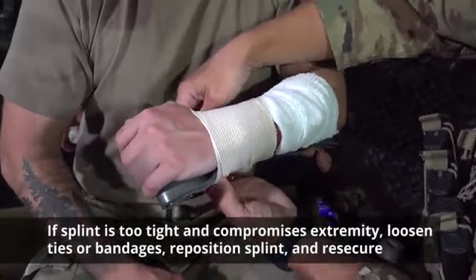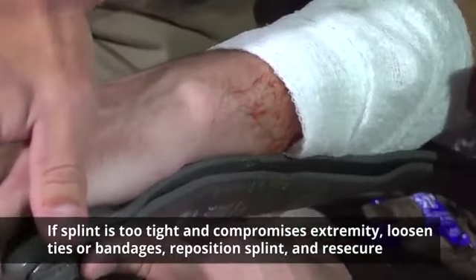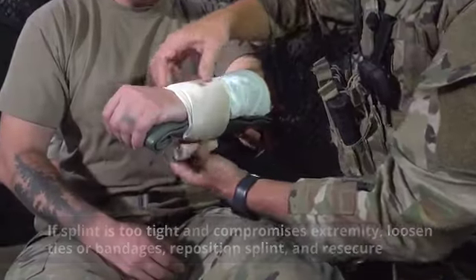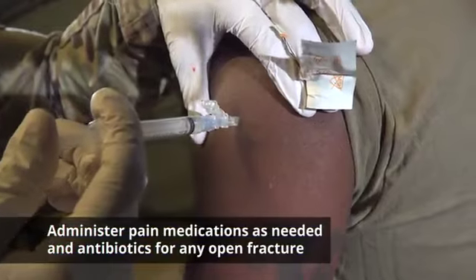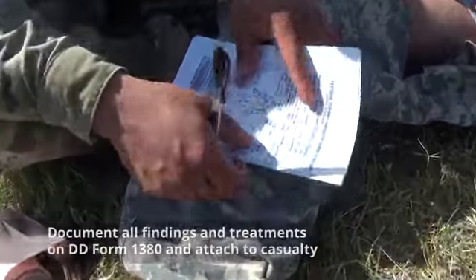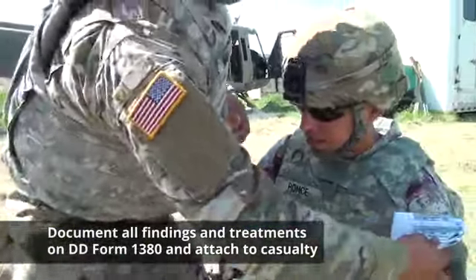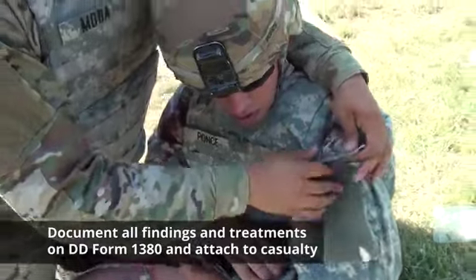If the splint is too tight and compromises the extremity, loosen the ties or bandages, reposition the splint, and then re-secure it. Administer pain medications as needed and antibiotics for any open fracture. And as always, document all findings and treatments on a DD Form 1380 TC3 casualty card and attach it to the casualty.